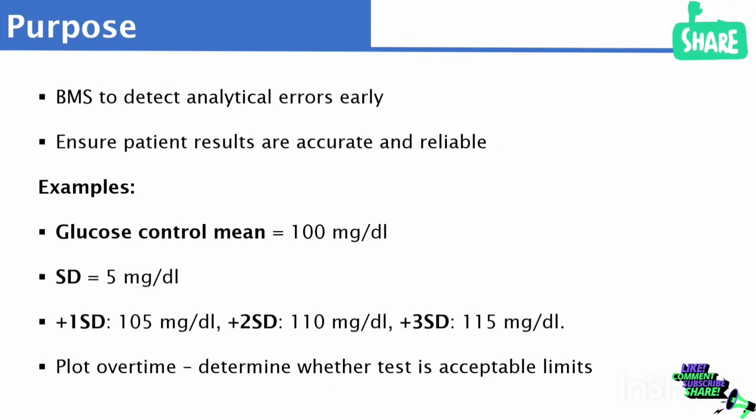So the Levey-Jennings chart tells you what to do, either to act if you suspect that the result you are producing is wrong, or to relax and say, okay, everything is fine based on what you've gotten. I think we'll look at this more. So the way I want you to look at this, imagine this is just an example, and because these questions, even though they are common in hematology, microbiology, immunology, and all of that, most times they significantly come out in biochemistry, that is why I chose to use glucose as an example.